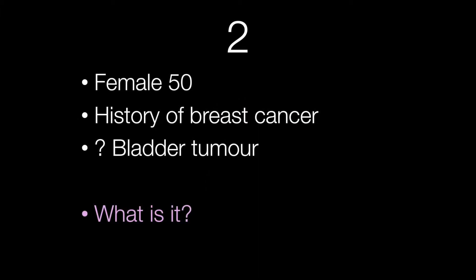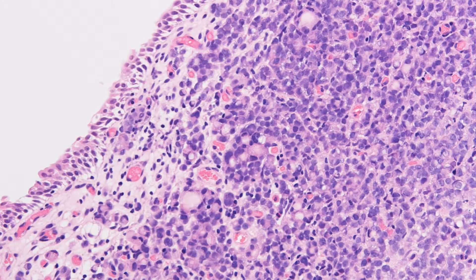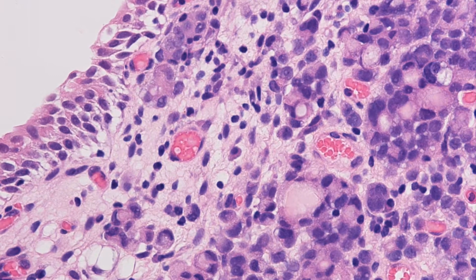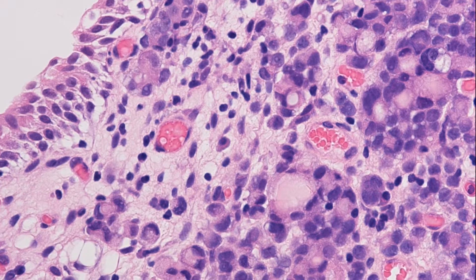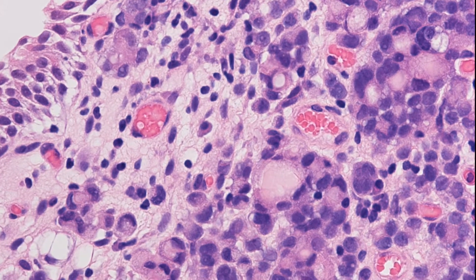The second case is a female of 50 with a history of breast cancer. She was found to have a lesion, query bladder tumour. What is it? Here is a low power view. Have a look at the urothelium — do you think it's normal? Here is a high power view which should enable you to make the diagnosis.